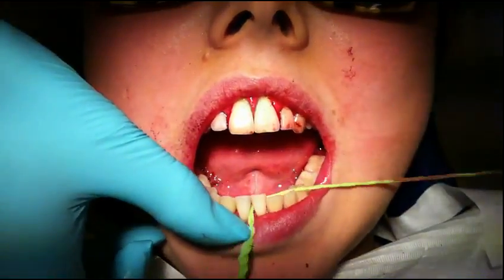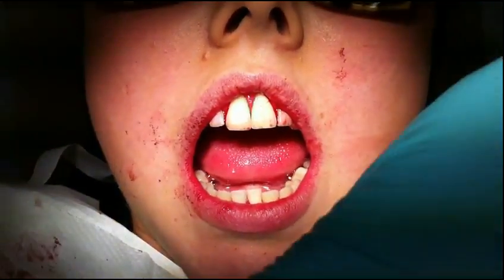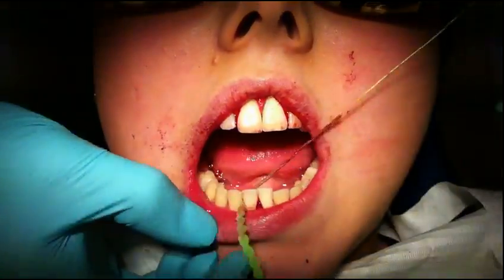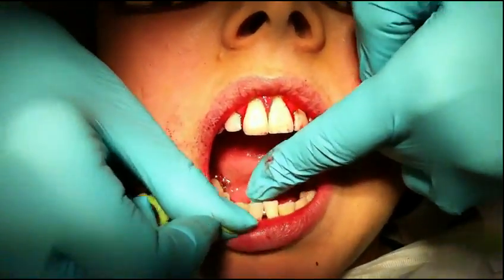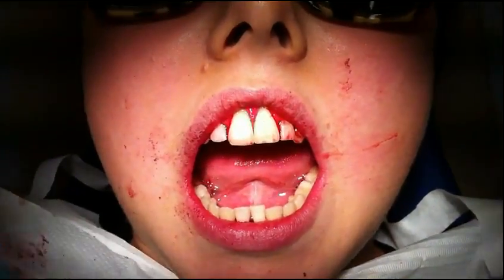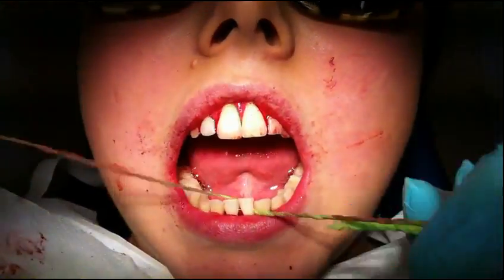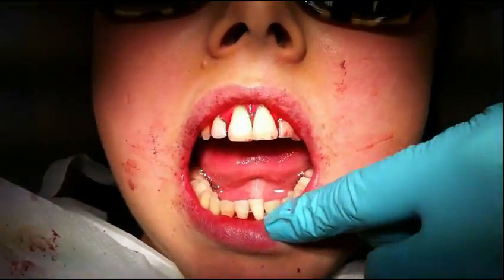To clean sub-gingival — I keep repeating myself, but interdental brushes will have some effect; however, when it comes to sub-gingival cleaning, we need to use some kind of floss. So for perio cases, this floss is fabulous.